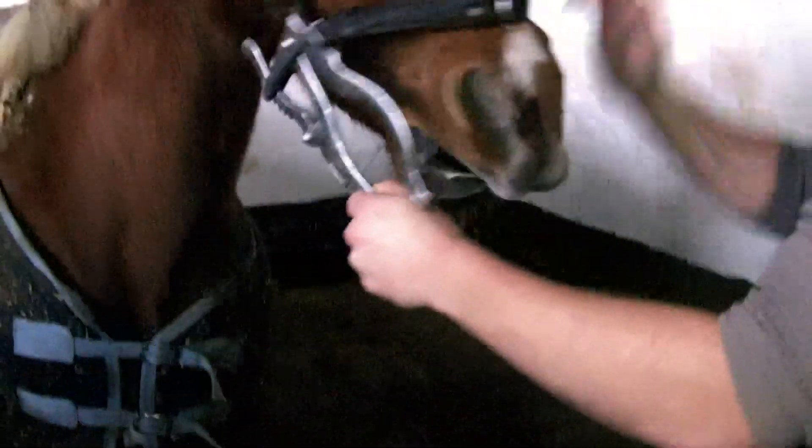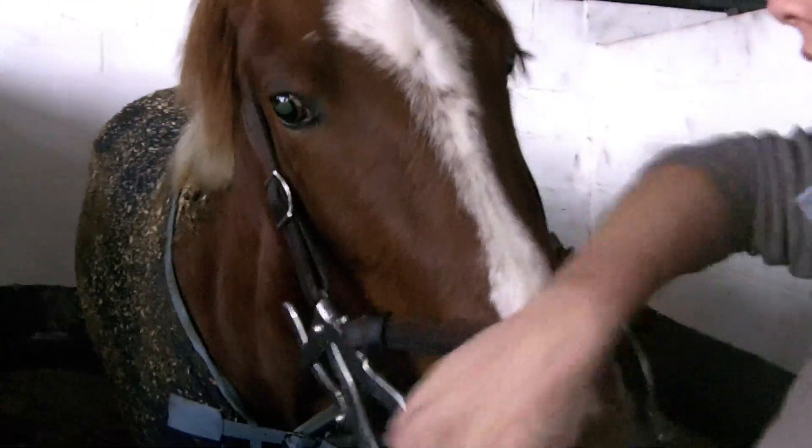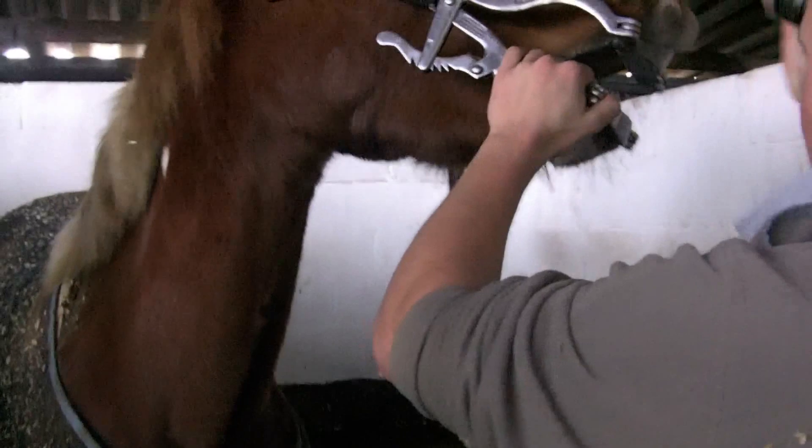Okay, let's have a look then. What are we meant to be looking at? Back molars, 6s to 11s. Caps on front 6s, 7s and 8s.